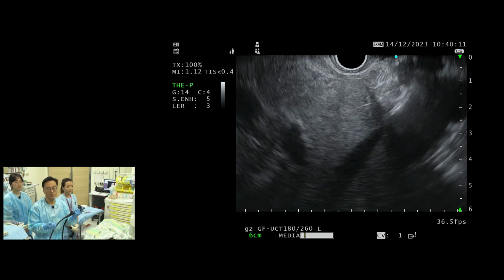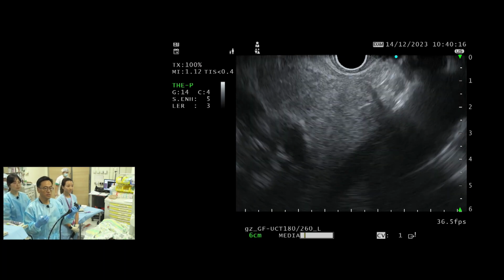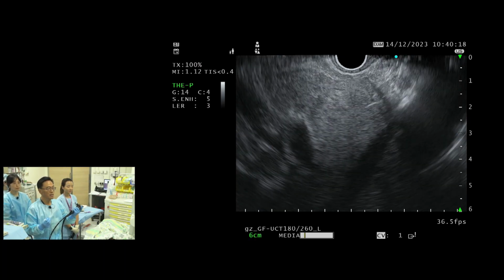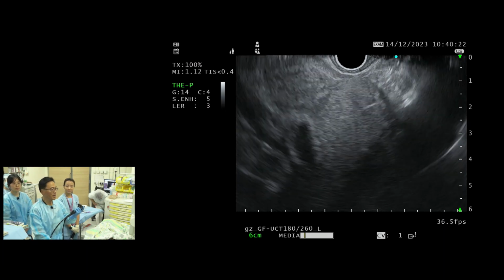We see gastric varices, so we know the patient has portal hypertension. Does knowing the actual gradient help us and inform us? So I'd like to hear what the panel thinks.